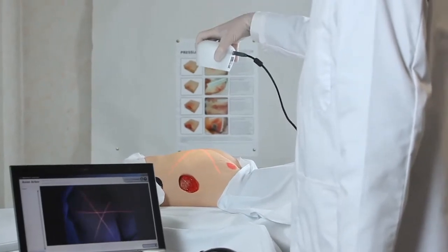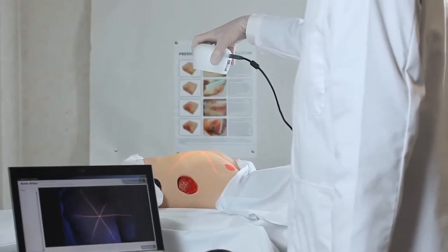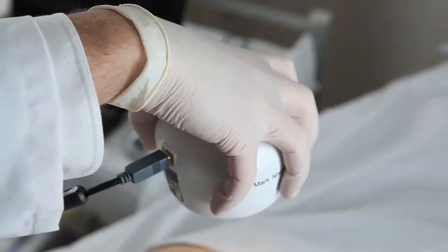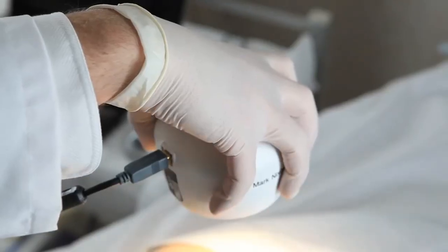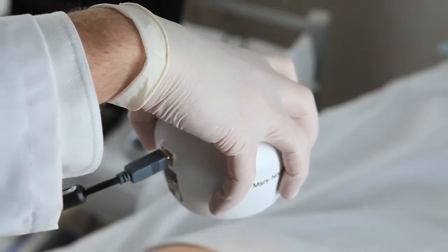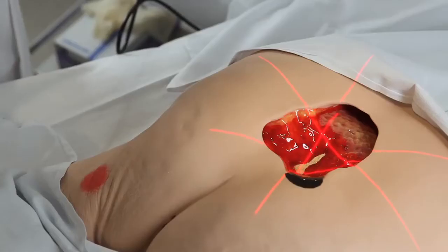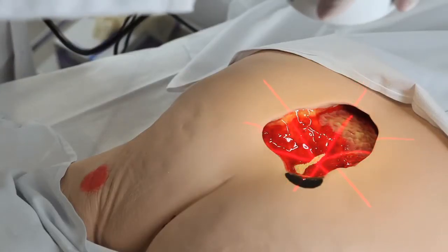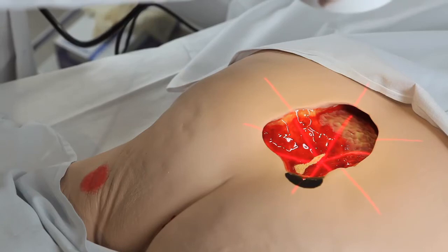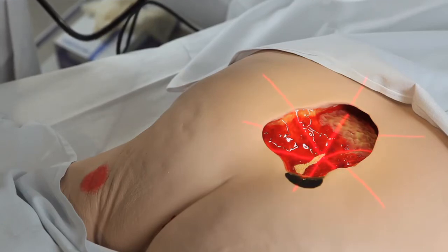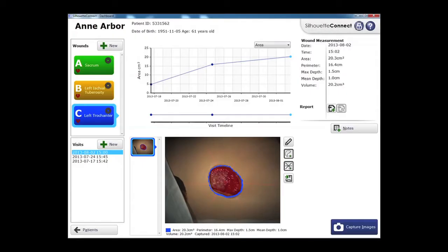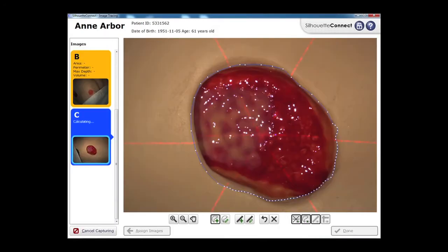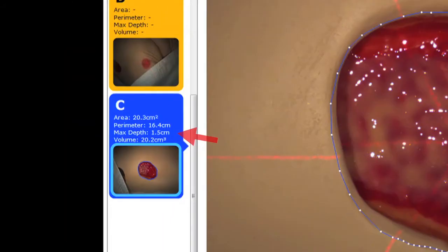The Silhouette Star wound camera takes high-quality images. Using laser technology, Silhouette automatically calculates the area, depth, and volume of wounds and their healing progress. Silhouette offers the gold standard in measurement accuracy, including depth, a critical metric in wound progression.